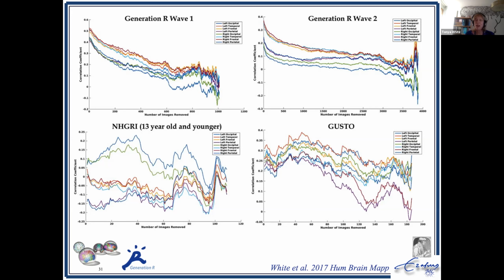I think I see. I'm not using cortical thickness here as a quality measure. That's not the goal. The goal is the other way around, to look at whether the quality of the scan affects the measure of cortical thickness. So the cortical thickness here is not what I'm using for quality. I just wondered if, Pradeep, you thought that I was using the cortical thickness as a quality measure.